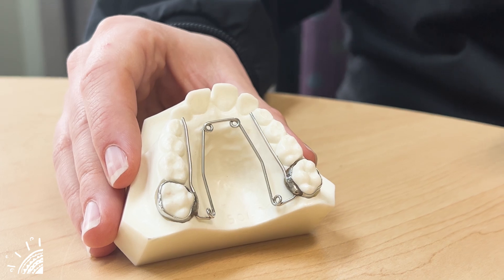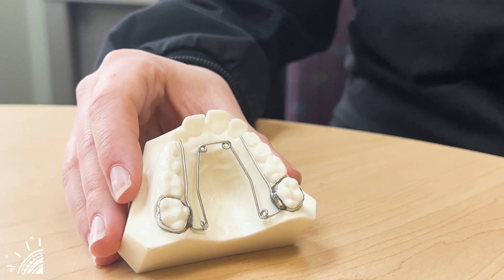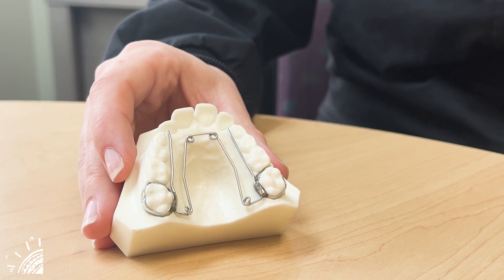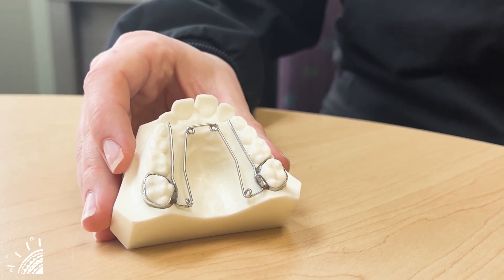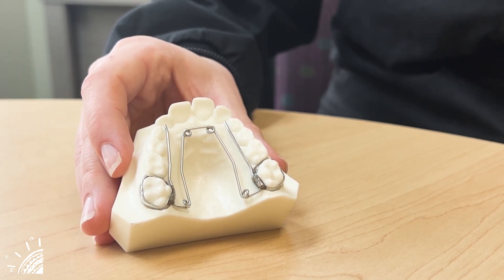Soreness the first few days is commonly reported, so just having some ibuprofen, Tylenol, and softer foods on hand. Bread likes to get stuck up in these little arms, so having some water to swish helps. Otherwise we will supply you with some tools to get all of that bread, food, and gunk out of there.